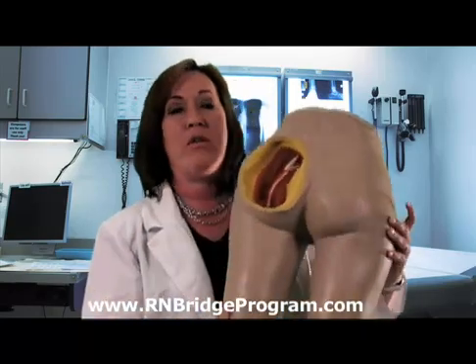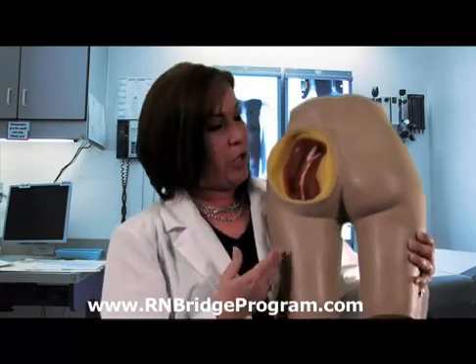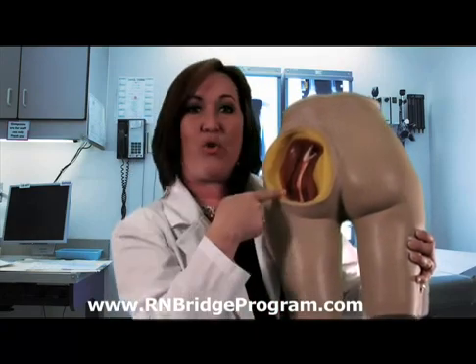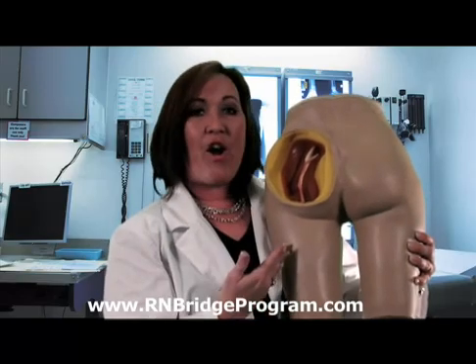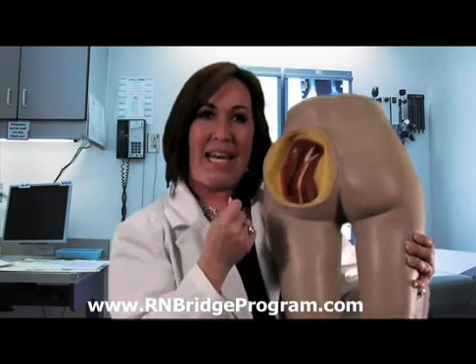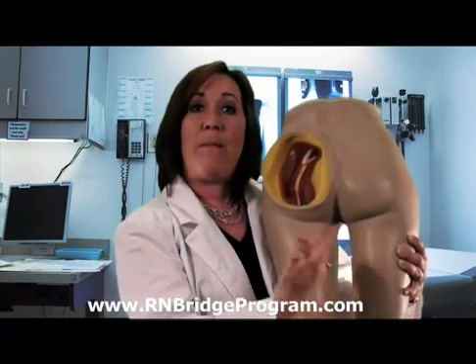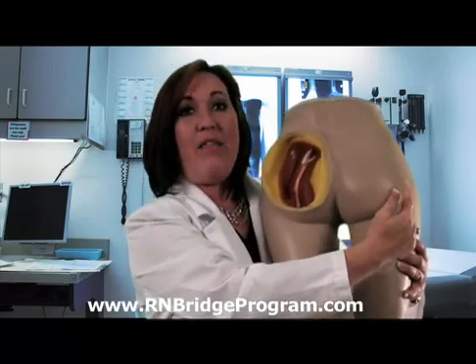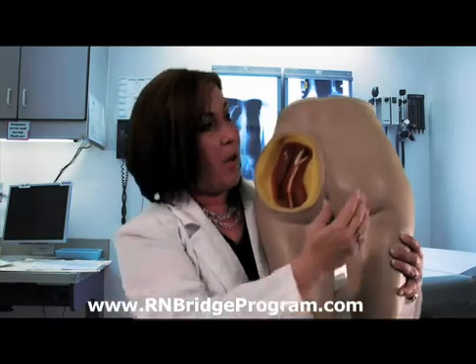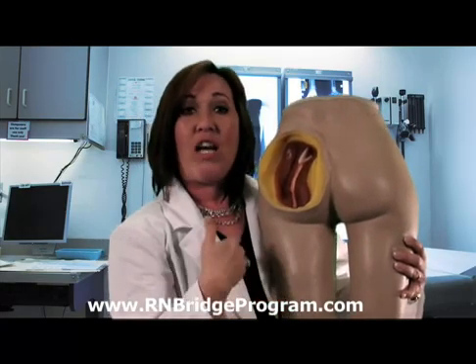We're going to talk about how to give the injection and the appropriate landmark for that specific IM injection. Here I have a model of the patient with the gluteal muscle exposed, also showing the sciatic nerve that runs directly in the middle of that muscle. When we find our landmarks, we want to make sure we're not going directly into that muscle because we're going deep and we don't want to hit that sciatic nerve. We draw an imaginary line both vertically and horizontally, and then we're going in the upper outer quadrant of this muscle, so that we stay far away from that sciatic nerve, causing less damage to the patient.